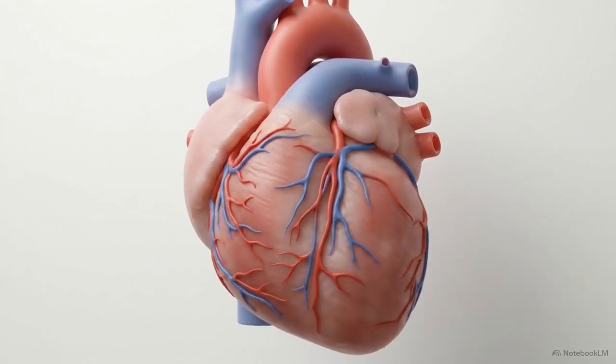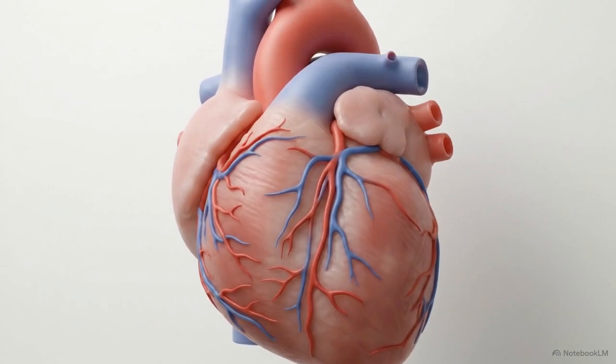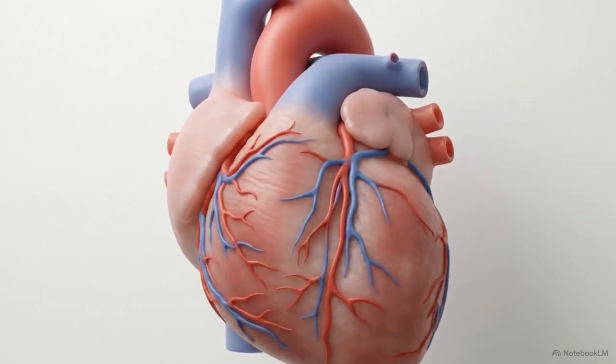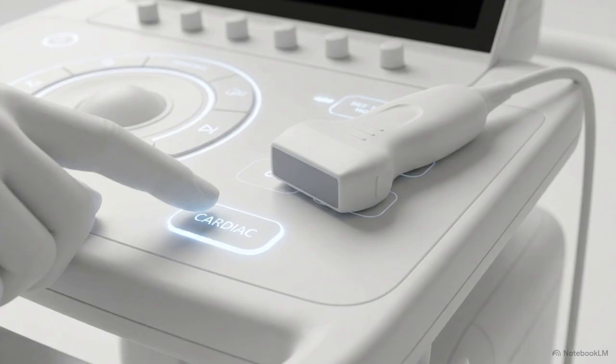To perform a complete, independent bedside cardiac ultrasound, you must capture the human heart from 5 specific windows. Step 1 is your physical setup. Lay your patient flat in a supine position. Select a phased array probe and set your machine to the cardiac preset.